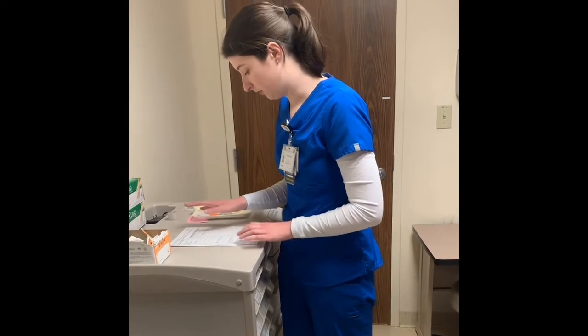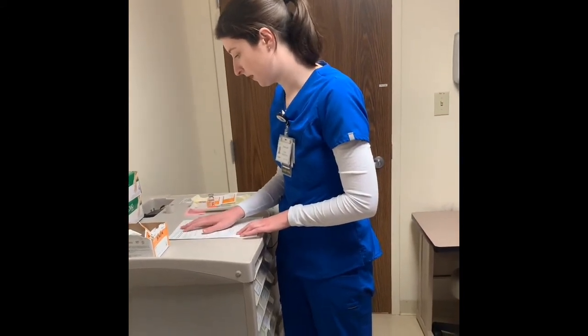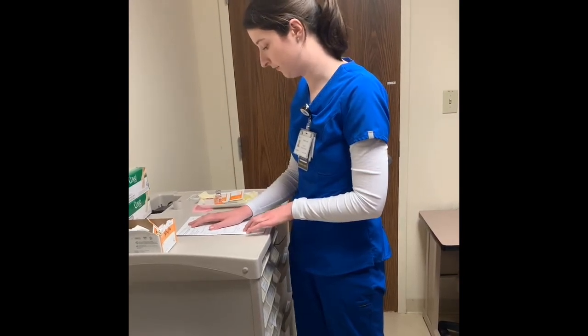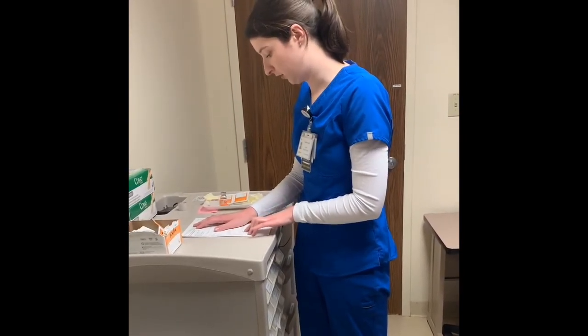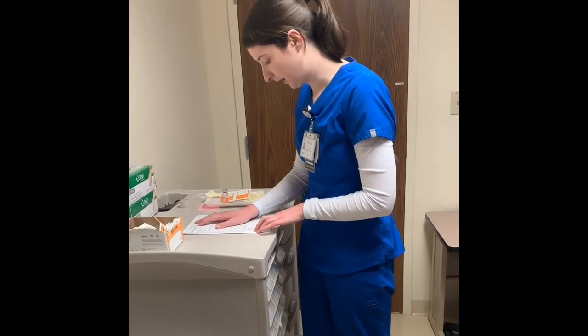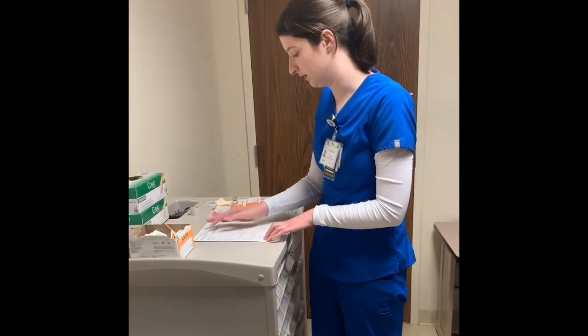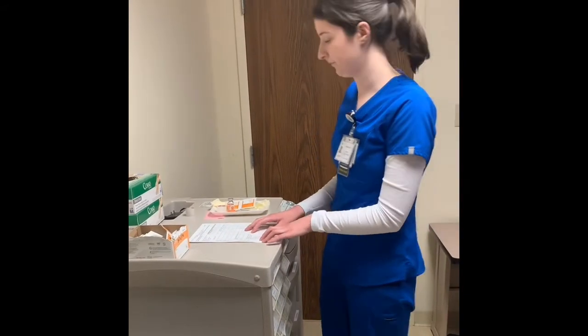So just to double check, the patient's most recent fingerstick blood sugar level was 355. According to the regular insulin sliding scale, I should be administering 20 units of regular insulin subcutaneously at this time.